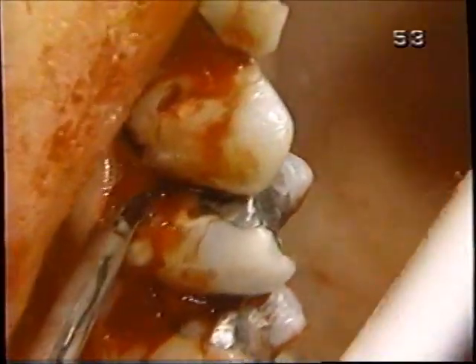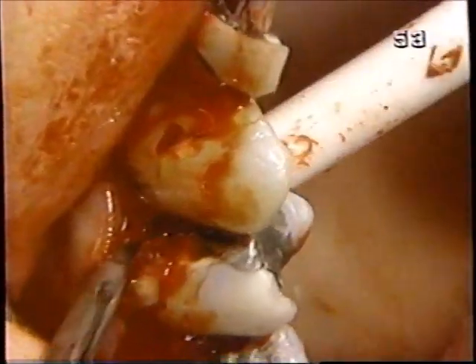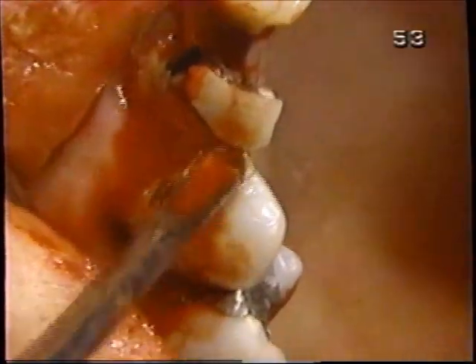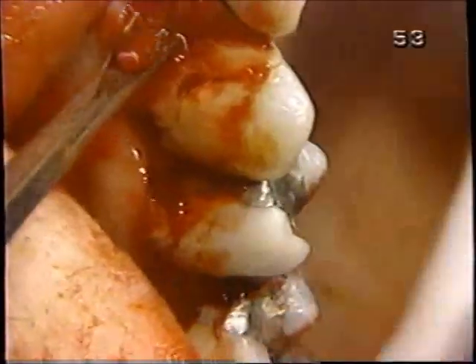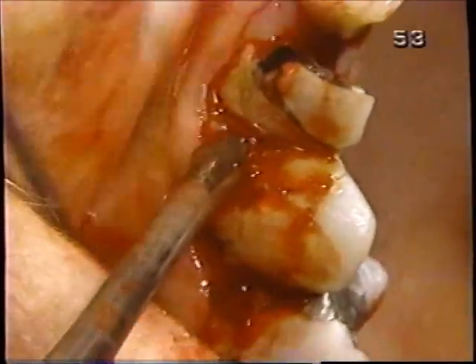There's a slightly different vector of force in each case. And certainly in this instance, you would do it both ways. And because those papillae are already severed, you don't really care if you smash them.